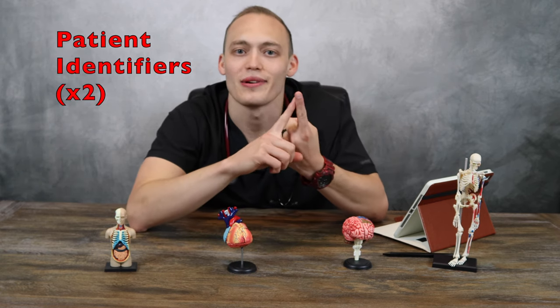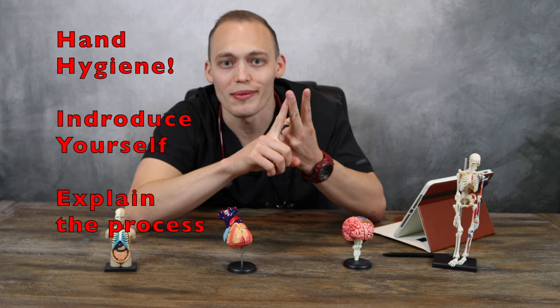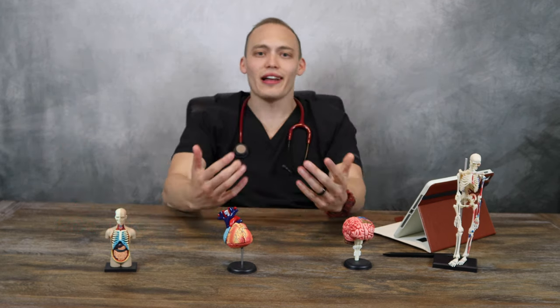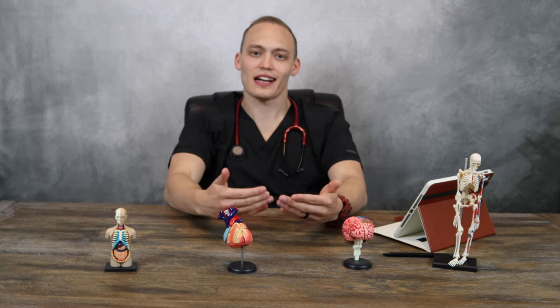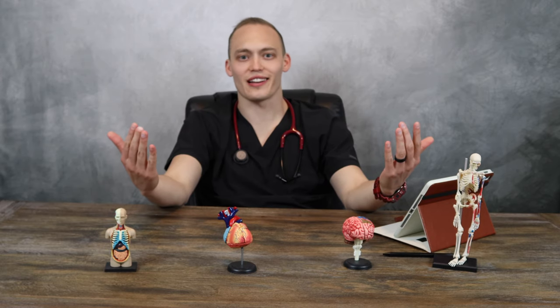Those are the basic vital signs. We're going to show you guys how to take a quick set of them. But before we do, there are some important things you should always remember. Always identify your patient with at least two patient identifiers — the more the merrier, that way it prevents mistakes. Always perform hand hygiene. Introduce yourself and let your patient know what you're going to be doing. When you let your patient know, it generally calms them down, makes them less anxious, and they know exactly what to expect. If the setting is appropriate, I personally like to crack a joke — but it's important to gauge the setting.